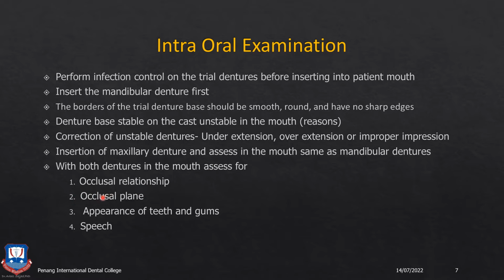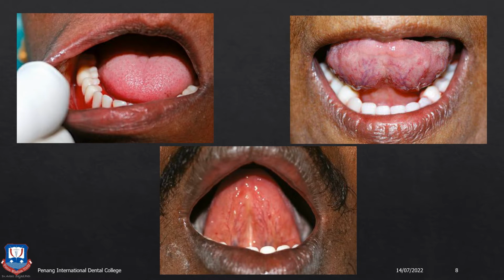And you verify the occlusal plane, whether it is parallel to the interpupillary line and the ala-tragal line, whether it is canted towards one side, or whether there is excessive display of the teeth and the gums. So all these things in a nutshell are checked in the examination. So first, as I mentioned, you insert the lower denture and check the peripheral border seal. You check for any underextension or overextension of the denture flanges, which may indicate an error in recording the secondary impression border molding. Then you check for the level of the occlusal plane.